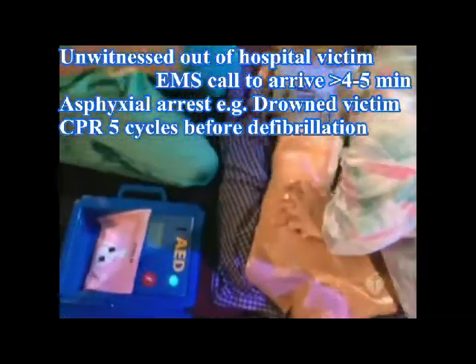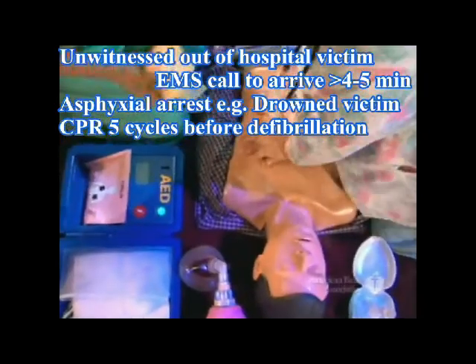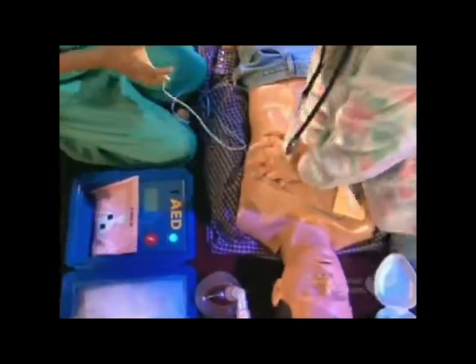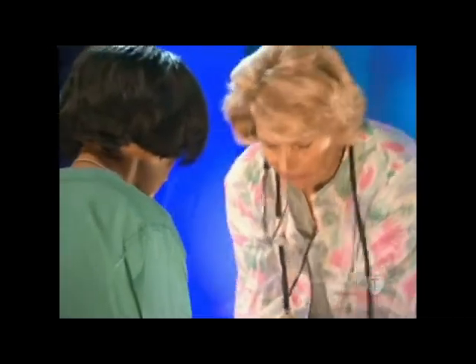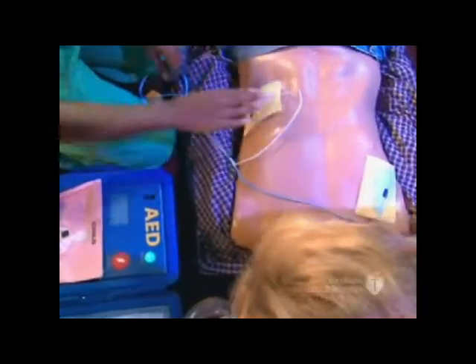Open the AED pad package and peel off the plastic backing. Press the sticky side on the victim's bare chest. Place one pad on the upper right side of the bare chest, to the right of the breastbone. Put the other pad a few inches below the left armpit.